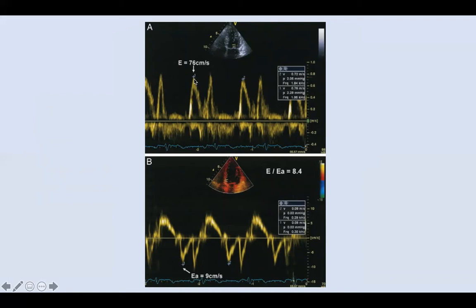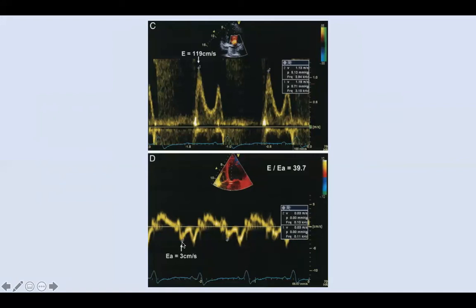To measure E/E prime: on the mitral valve Doppler, measure E from the menu under mitral valve. Then for tissue Doppler, at the septum at the mitral valve annulus, press PW to get E prime and A prime, then go to menu, mitral valve, E prime, and measure E prime. You should get the ratio automatically. An E/E prime of 8.4 is normal. However, if E prime is very small and the ratio comes to 39, that is very high and indicates diastolic dysfunction.